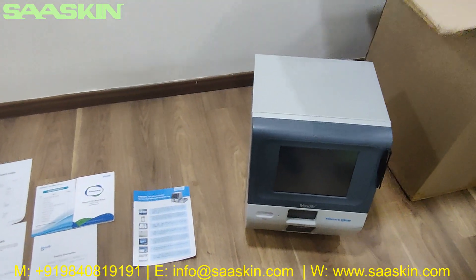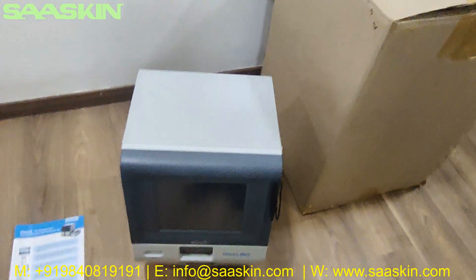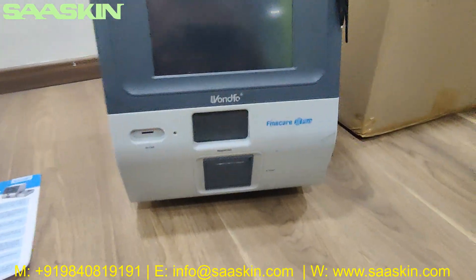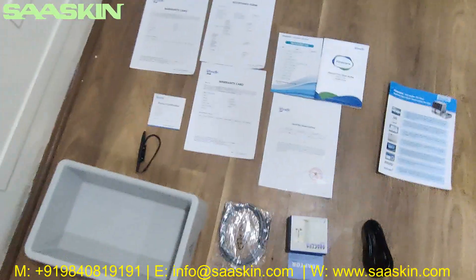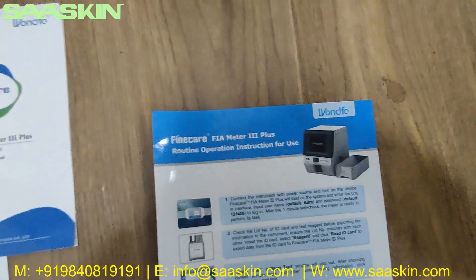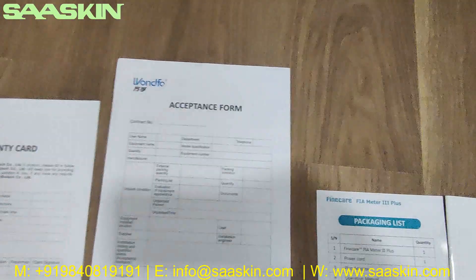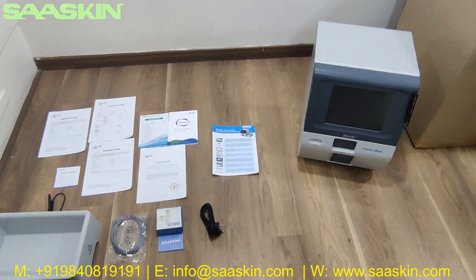Let me quickly summarize. This is the Fine Care Meter 3 Plus, model number FS205. Along with the machine, you get a tray, an additional marker pen, a network cable, a power adapter, and a power cable. You also get a routine operation instruction for use, an operation manual, a packing list, a quality guarantee, a warranty card, an acceptance form, and a product certification.